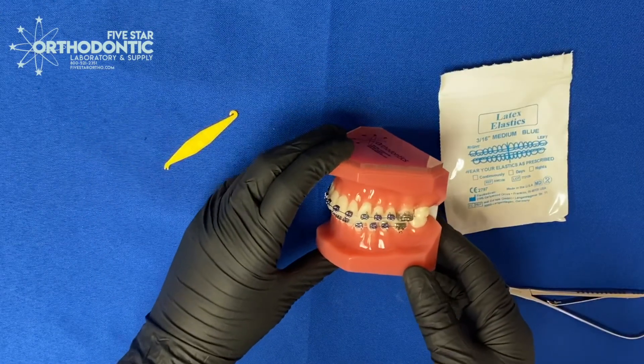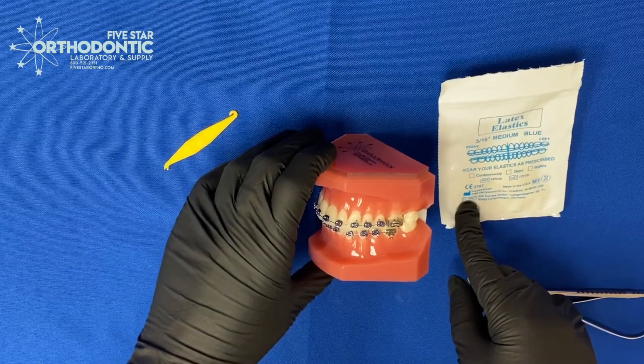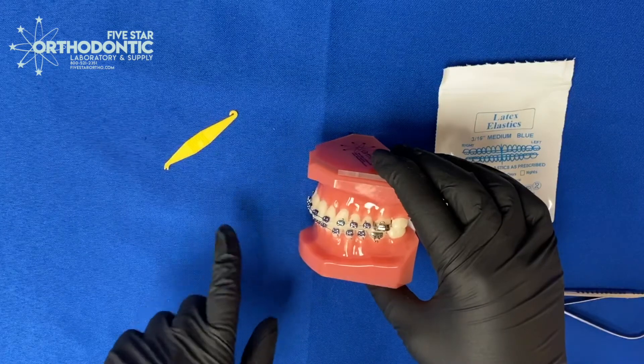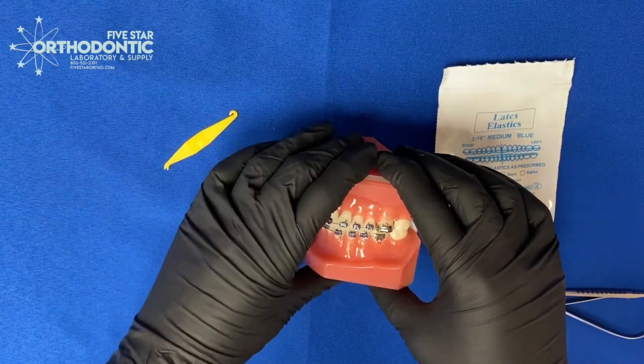So let's get into a demonstration. For vertical elastics, we recommend our 3/16th medium elastics. Those are called Venus in our line. I would recommend showing the patient how to attach these with the elastic attacher, since that's how they'll be doing it at home.